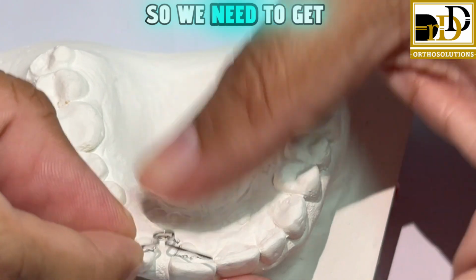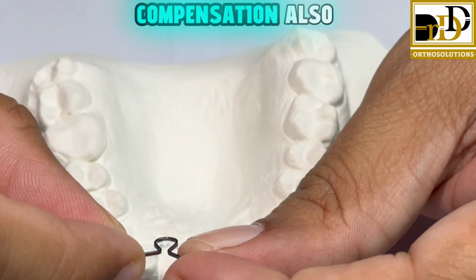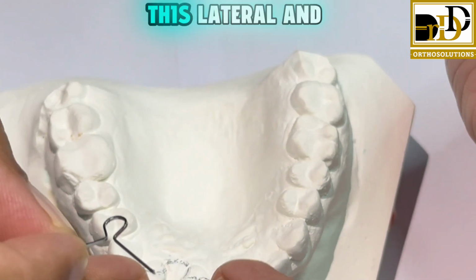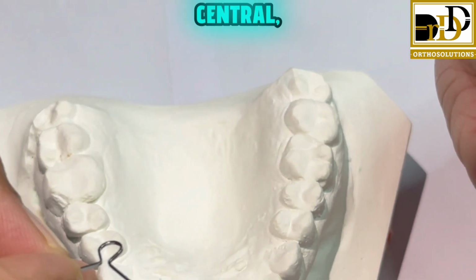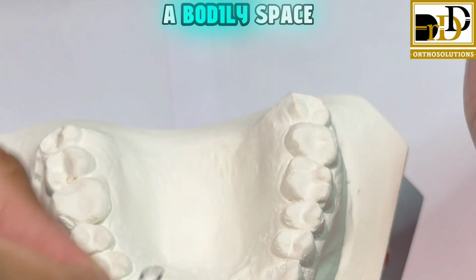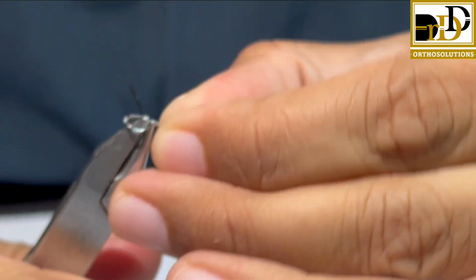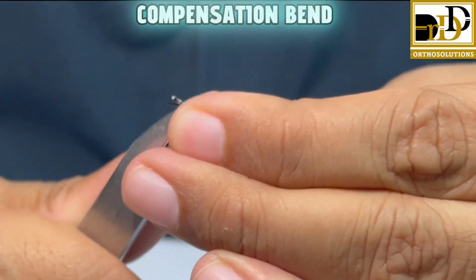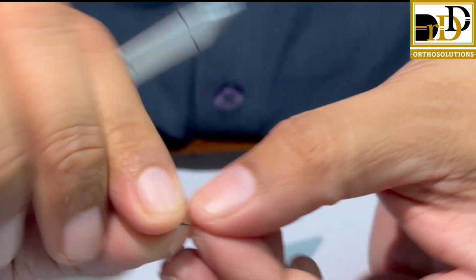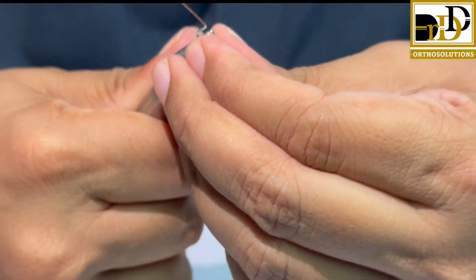So we need to get the space closed, at the same time it needs to have the compensation also for making a distal tip in both this lateral and central, so that when the space gets closed, we are going to get a bodily space closure. So for that, what we are going to give is a compensation bend in the loop like this.